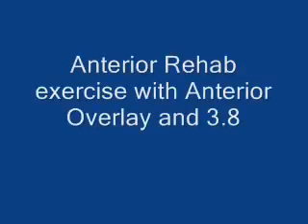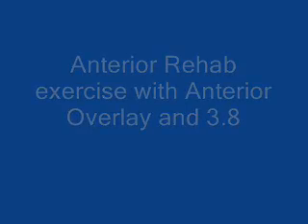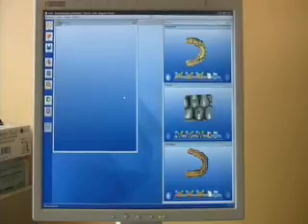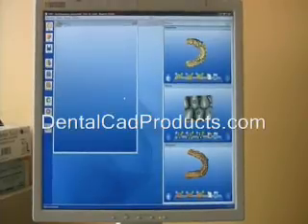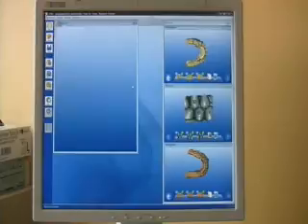In this video we'll be going over the anterior rehab of six anterior teeth with the 3.8 software. We'll be using the overlay from DentalCAD products.